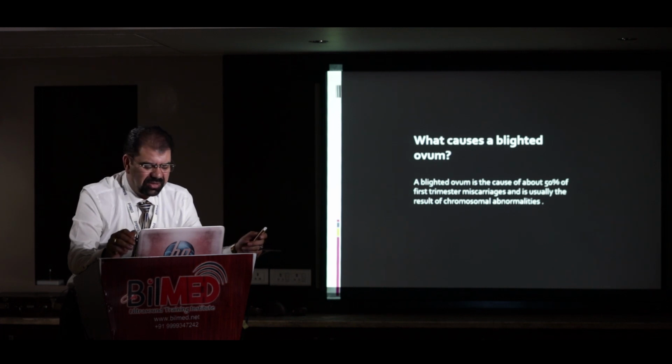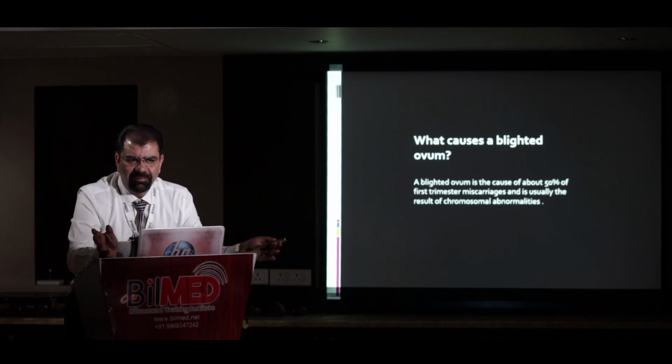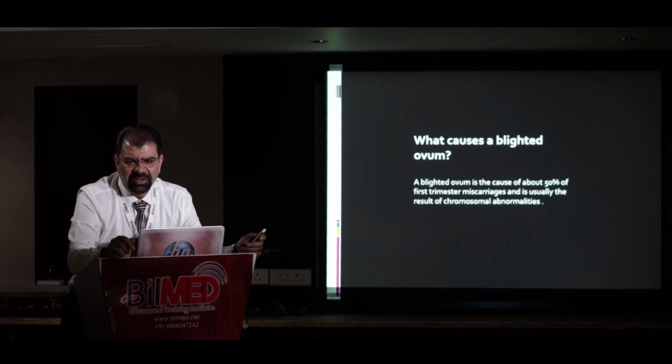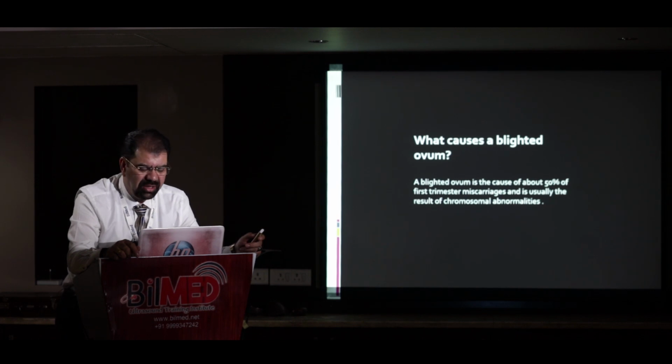So we'll not spend much time here because there is nothing to discuss. We have this gestational sac over here. We don't have any fetus, and the cut-off is 20. You are not seeing a fetus. You are seeing only the gestational sac with a measurement of 20 and more. And most probably you will be seeing a thin decidual reaction, and the cut-off, as already said, is that 2 millimeters of decidual reaction should be there at least, and I am seeing 1 only. So then I will not hesitate to label this as blighted ovum.